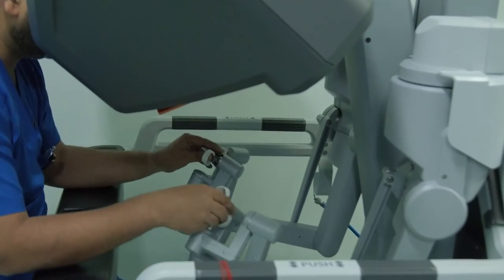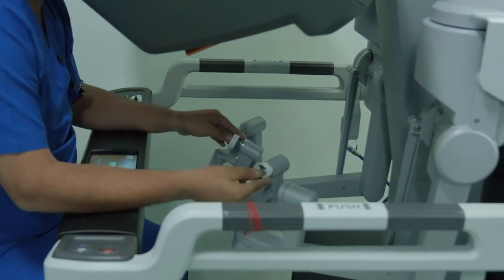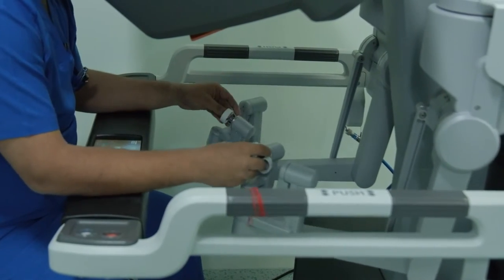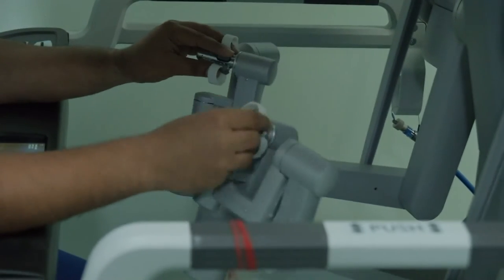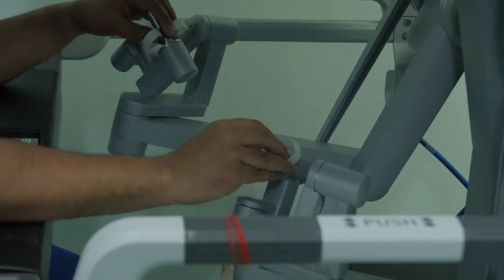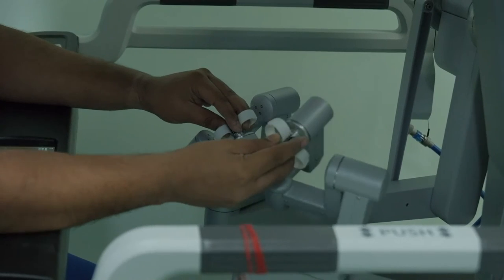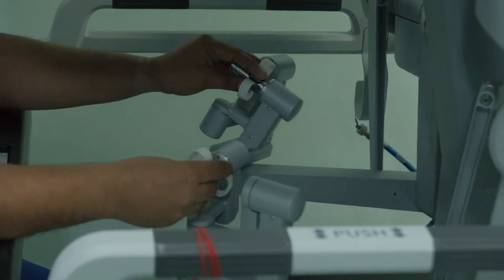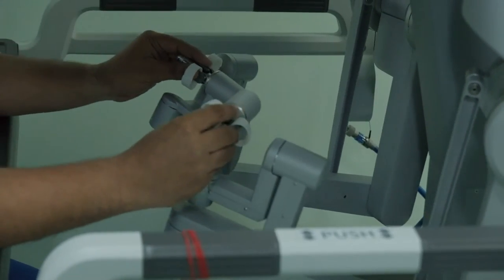So you need to bring both of them together in a way that you are able to operate from the middle. This can also be achieved by pressing this clutch button. And once you press this clutch button, both the instrument tips become free. With the finger clutch only, one instrument tip becomes free. So once we take a bite, then with these 7 degrees of freedom, we are able to tie the knot.